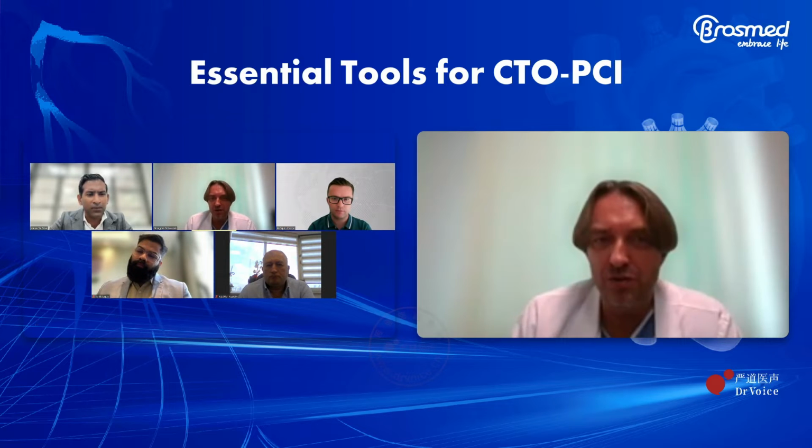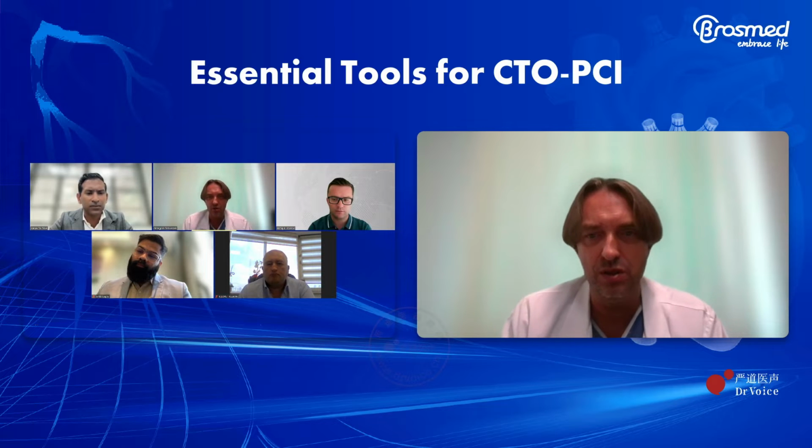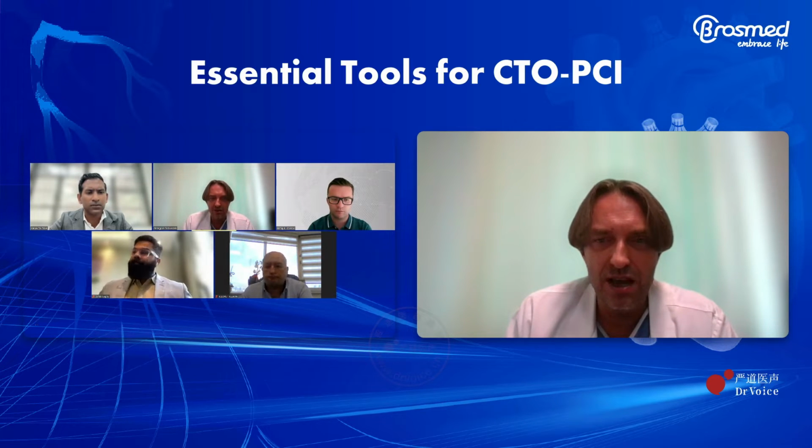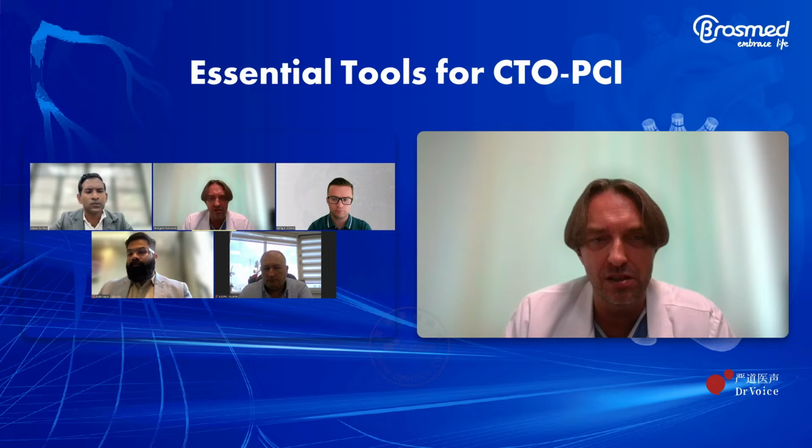Thank you for the question. Great question. I think it's an educational case because you can see many steps, many strategies we can use in an uncrossable lesion. And the next step for me will be external crush. I know it's a little controversial method, but I had experience with some cases and it was successful. So probably it will be external crush. However, in this artery that is not too big in diameter, it can be a problem of hematoma and losing the true lumen and visualization.